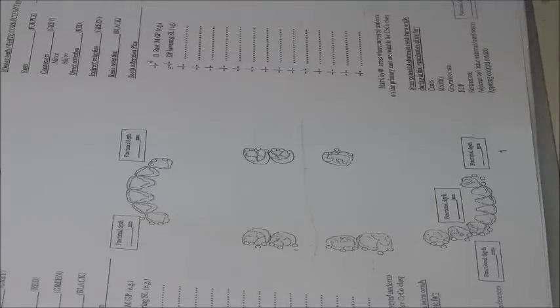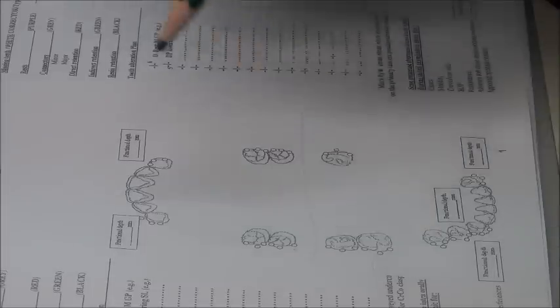Sometimes you have mobilities written, an undercut, unfavorable undercut, and so on. But once you have a design that nothing is there, it's empty, meaning that all undercuts are favorable, all functional depths are favorable, and we don't have any pathologies or lesions or fillings in the teeth. Okay? This is the empty form.